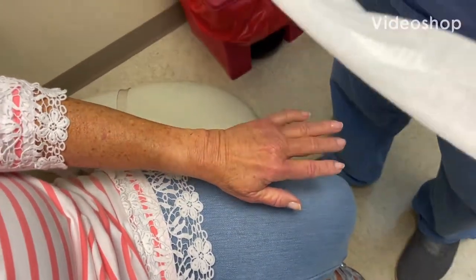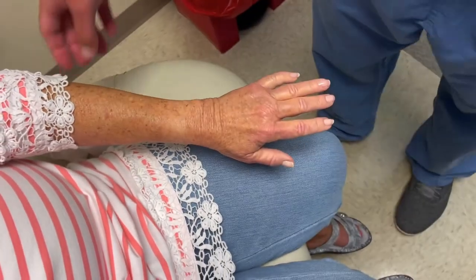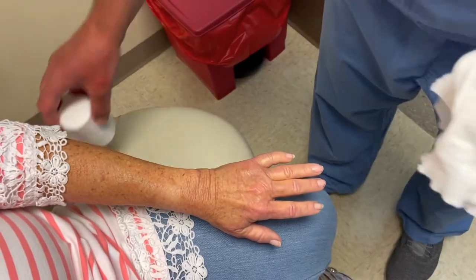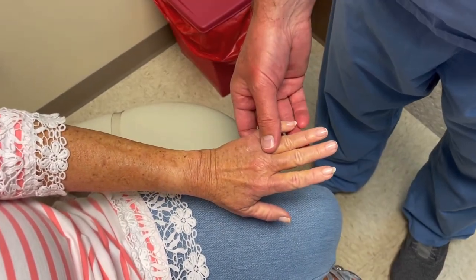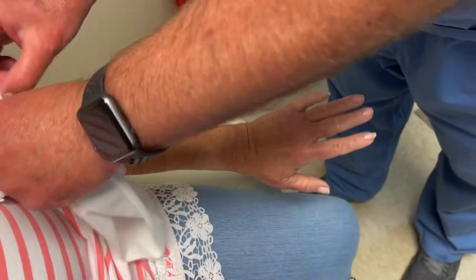This is an instructional video on how to put on the stockinette and the web roll padding before you put on a splint. The first thing we do is make sure there's no rings or watches, make sure the skin looks good, and kind of roll her sleeve up.